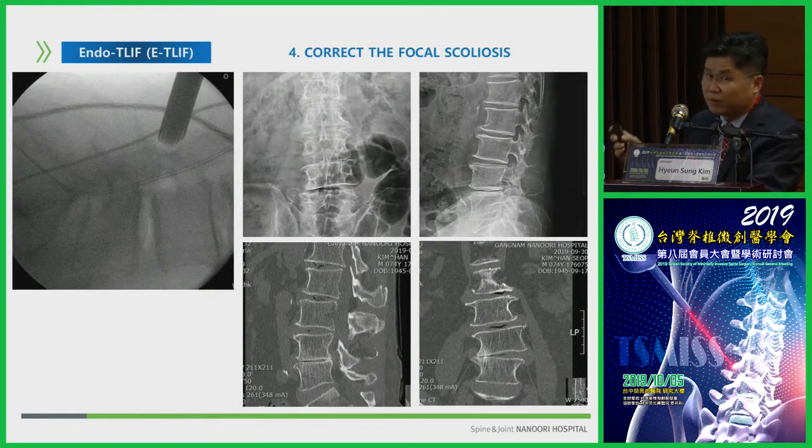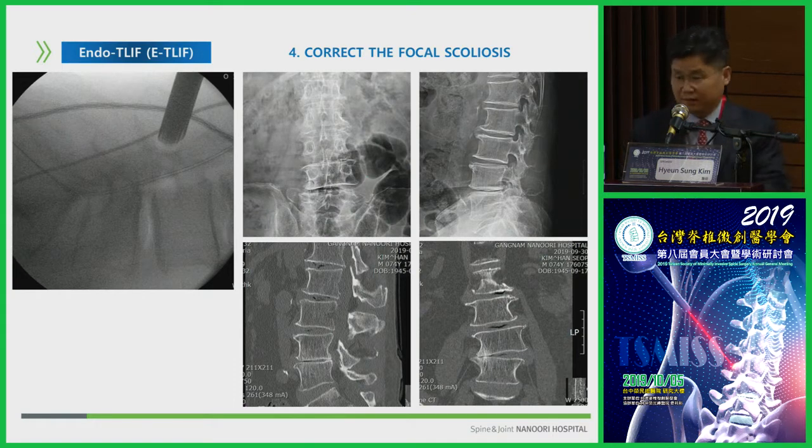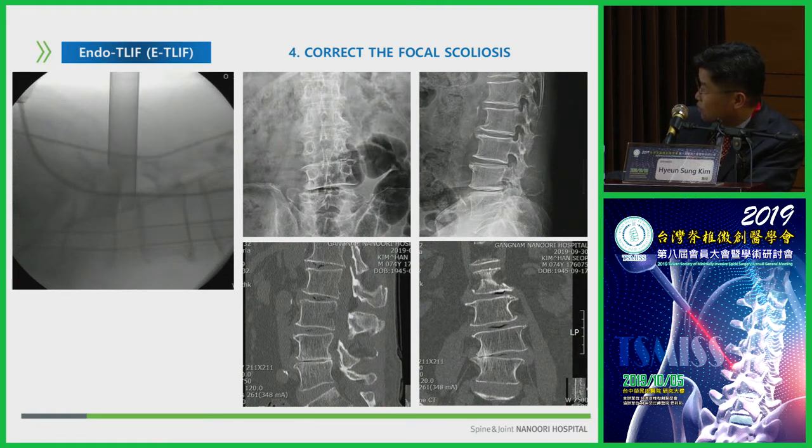This will be the real advantage of endoscopic fusion surgery. Also, this endoscopic process with radiofrequency ablation can increase the disc height. You can see here, and we can also perform the serial dilation to here, like this, and insert the cage like this.